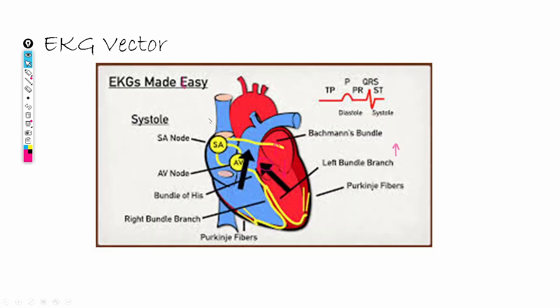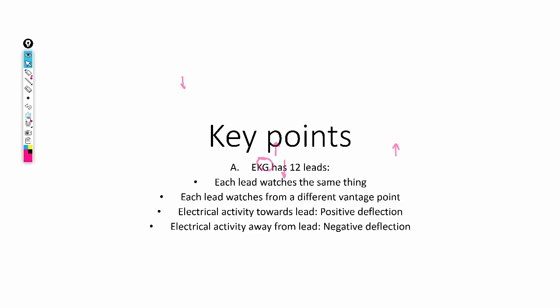Let me end this slide with an ending note. Go through it, EKG is 12 leads. I just went through this.